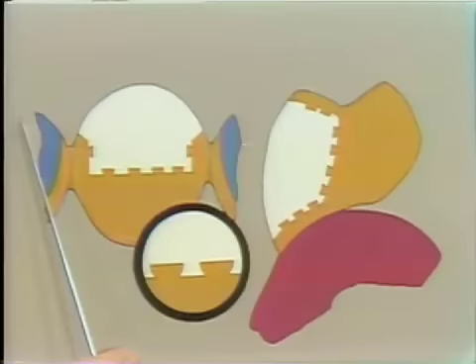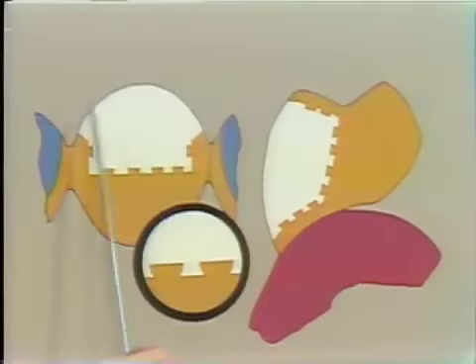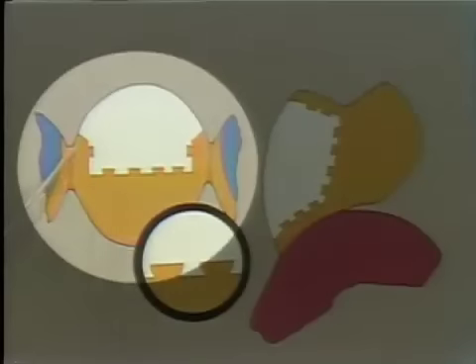If we take a look at this part of the diagram, which is a cross-section through one of these pontics parallel to the occlusal plane, the point which should be noticed here is the development of the window for the resin in this region here. It has to be extended sufficiently far to the buccal to enable a soldered joint or cast connector to be put in here without interfering with the facing. It needs to be tucked sufficiently into the interproximal space here that the gold is not visible in the normal view of the pontic, so that maximum aesthetics are maintained.